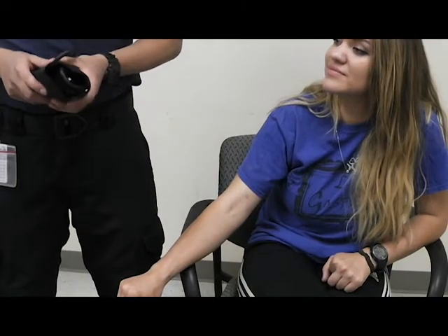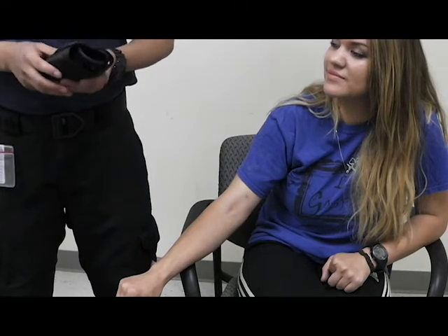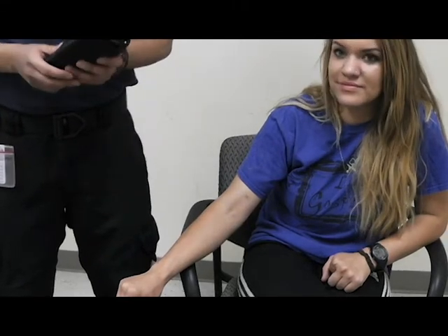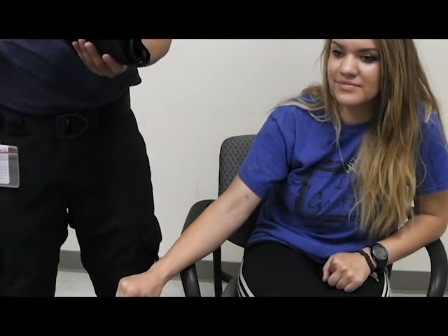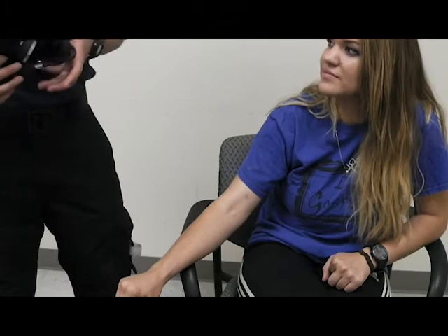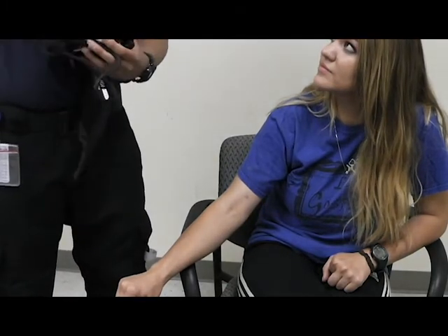This is a demonstration on how to take a blood pressure on a patient. For your blood pressure, you're going to have two numbers which you are going to record. You're going to record your systolic number, which is going to be your higher number, and your diastolic number, which is your lower number. The equipment you're going to need is your blood pressure cuff and your stethoscope.